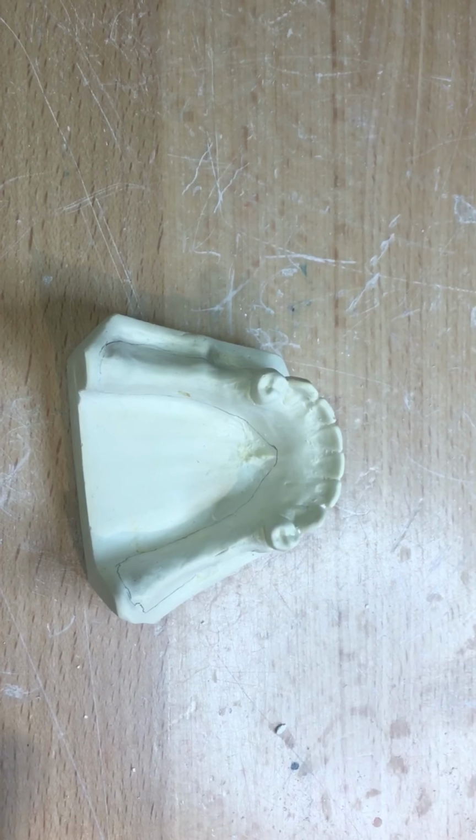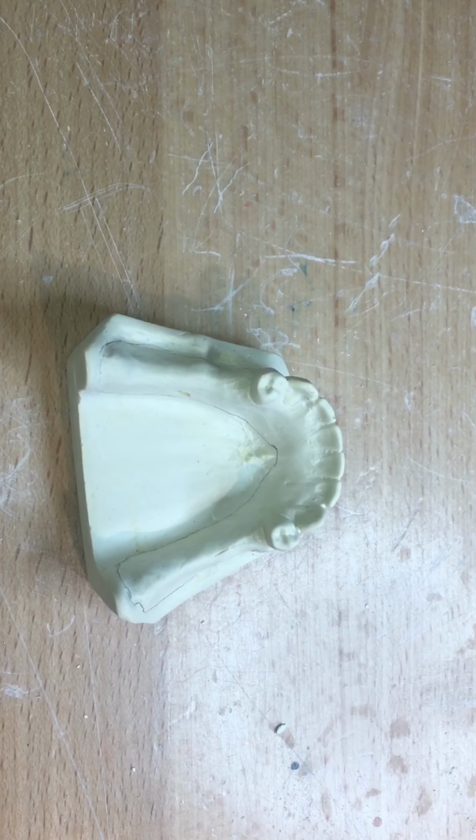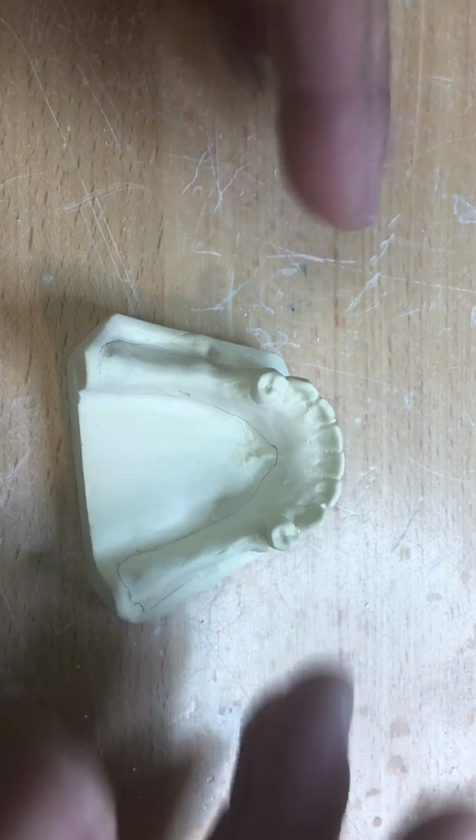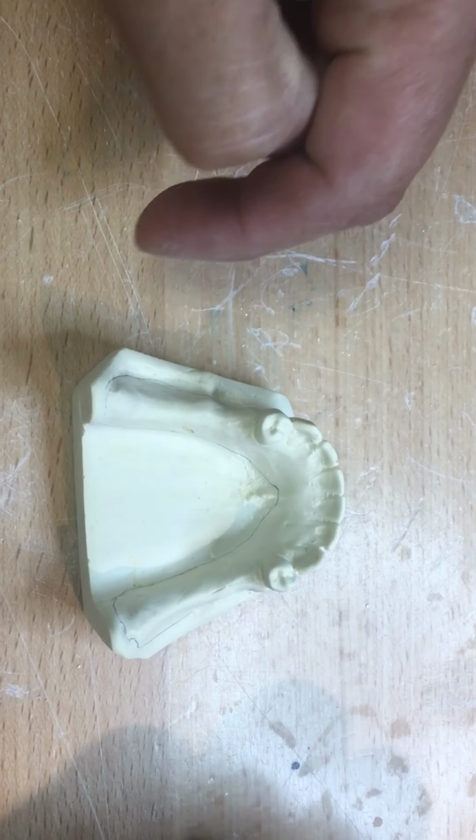Now, this is going to be for a cast partial treatment, but the procedures for an acrylic partial or an immediate denture would all be the same. So let's not try to compartmentalize our learning here. It spans across all the same three treatments.